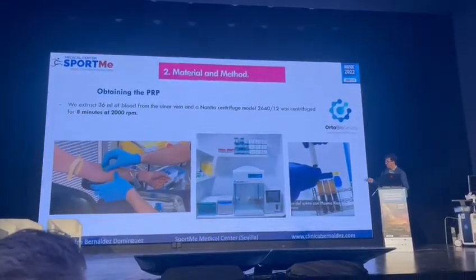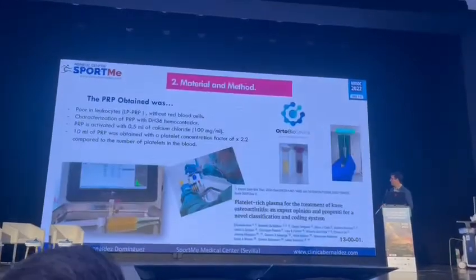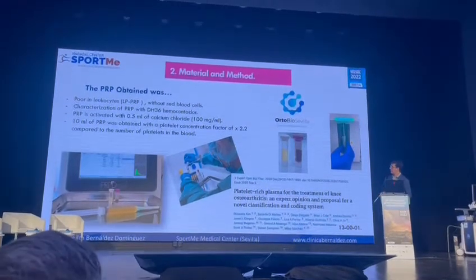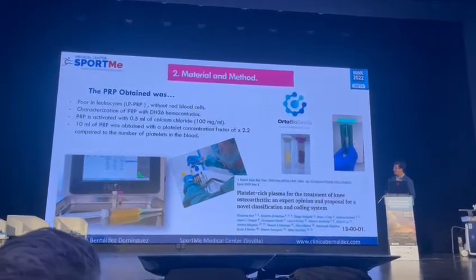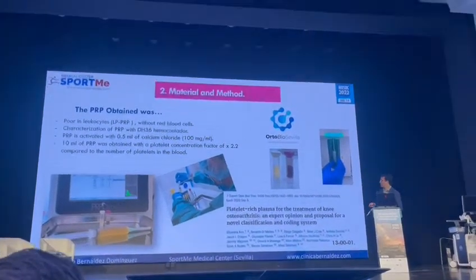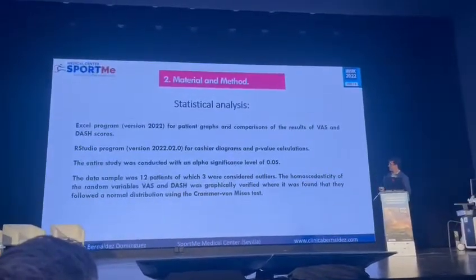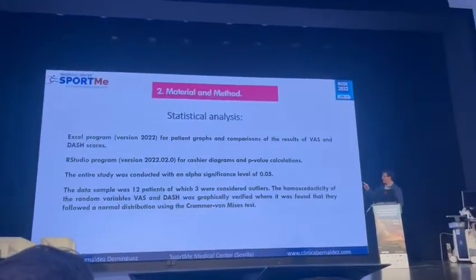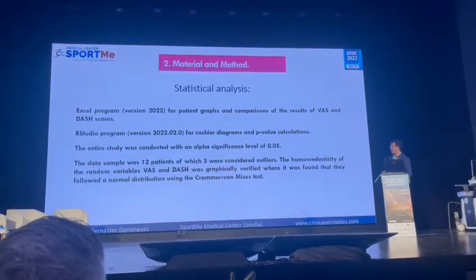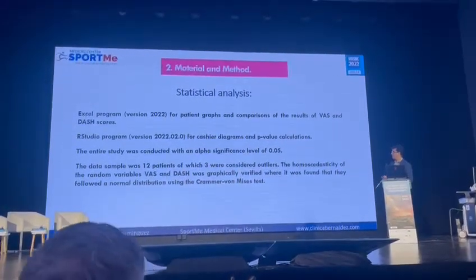This is our laboratory, Laboratorio Seville. You know the procedure of the PRP, it's not new. We characterize the PRP with a hemocounter, activate with calcium chloride, with a concentration factor of 2.2. Statistical analysis: we use Excel for graphs and comparison of the results of the VAS and DASH scores, and a statistics program for calculating relevance and p-value.